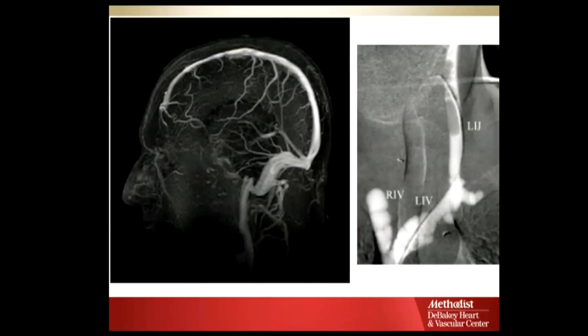One time, our neurosurgeon wanted to use the hybrid room because there was severe sagittal sinus thrombosis they couldn't really get access to peripherally. They bored a hole in the guy's head, put a catheter straight into the sagittal sinus and analyzed that. So there's a bunch of different ways you can get to some of these structures. Generally, when you're doing a carotid angiogram, you're supposed to follow it through into the sinus phase and the venous phase for the completion of the study.